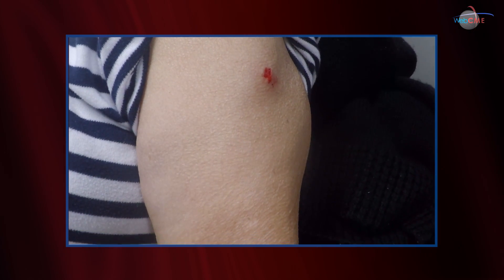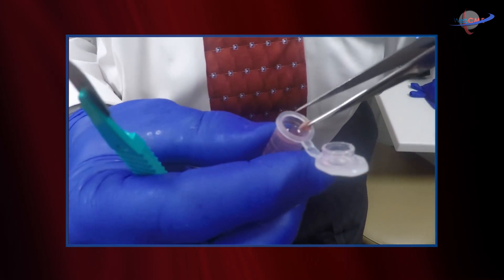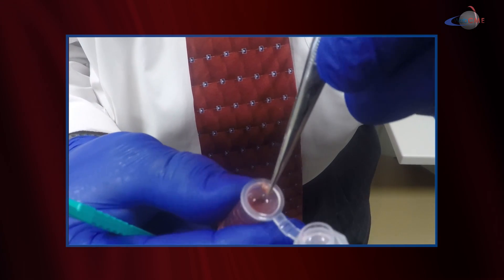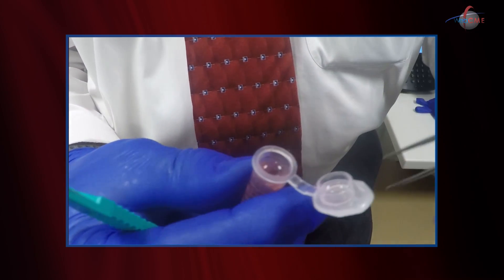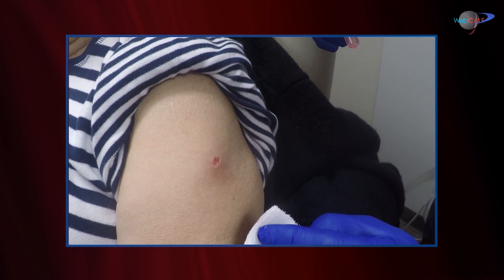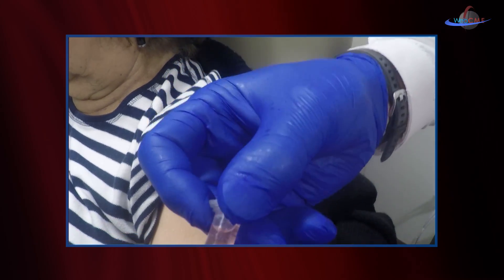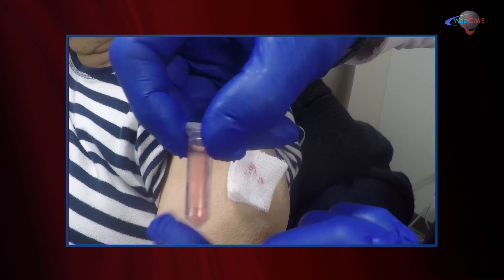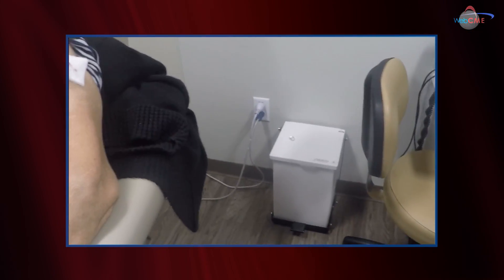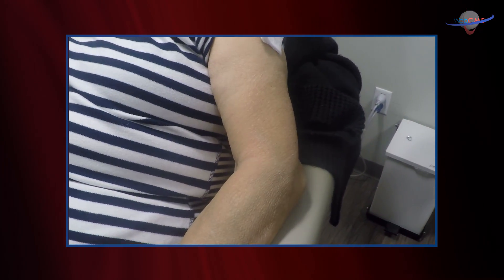That should be enough. So now we've harvested the skin. This is a little specimen container — that's where the skin goes. You'll see our biopsy site is really superficial; we'll put a little dressing on that and it'll heal nicely. You can see our skin samples in there, which will be sent off to create the graft. And then we need to take a little blood specimen, which will also be sent off to the lab.